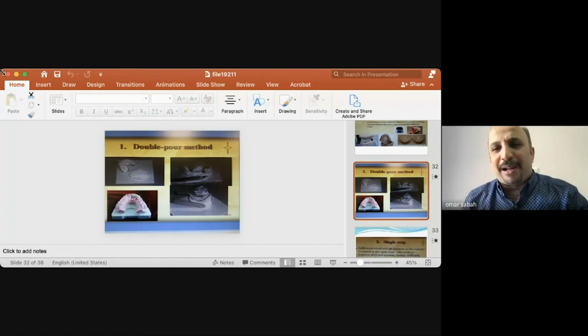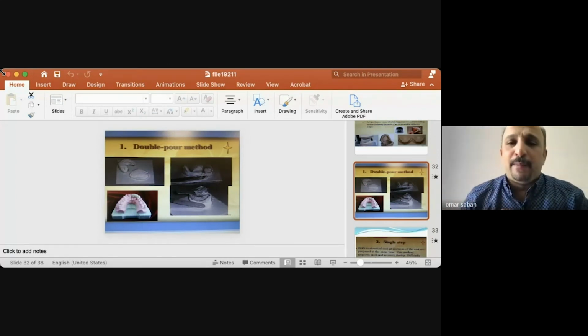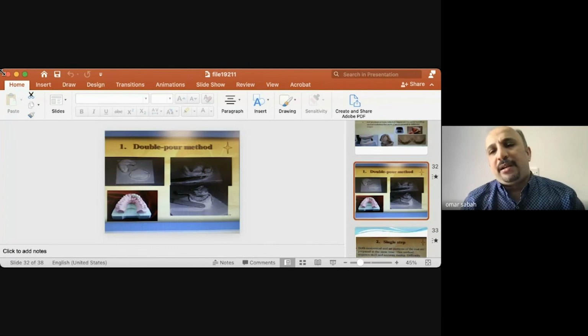فراح اخذ الامبريشن راح تكون دقيقه جدا جدا، بحيث الماتيريال تفوت باي اندر كات، تفوت باي اناتوميكال ستراكشرز، تسجل لي كل الاناتومي ستراكشر. ولهذا الماتيريال مال فاينل تختلف عن الماتيريال مال برايمري. ولهذا انه انا اعمل فاينل، يعني لازم تكون الديتيلز مالي كلش دقيقه، انه الدنشر اي بارت من المليم away from the soft tissue hard tissue راح افقد الريتنشن مالتي.